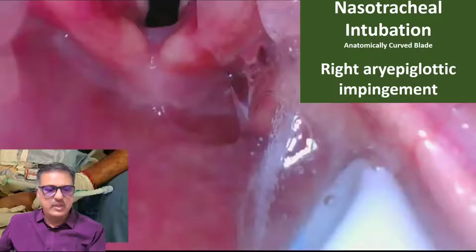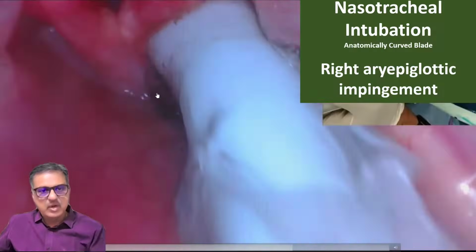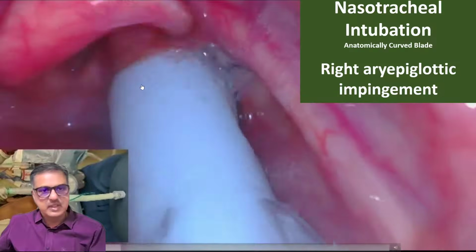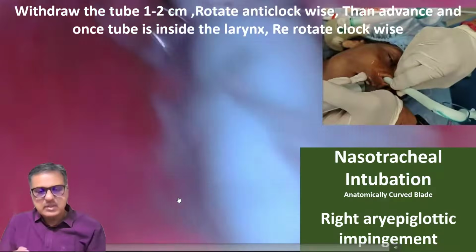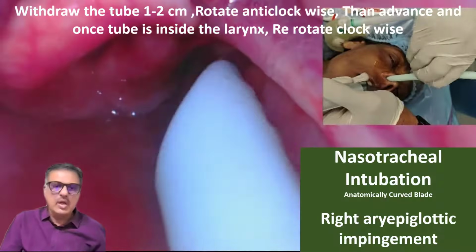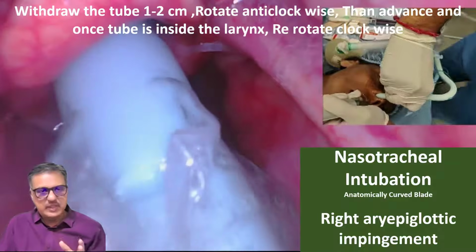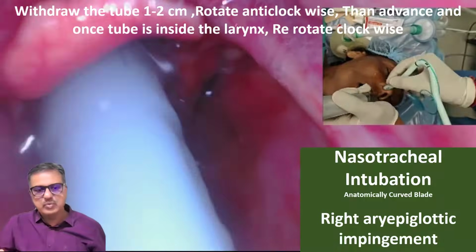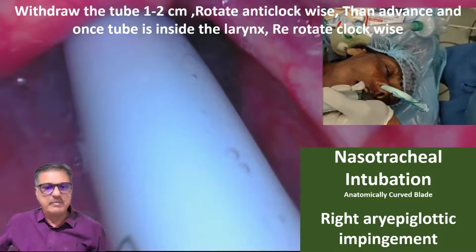Look at this video. In this video, the endotracheal tube, the nasotracheal tube, is impinging over the right aryepiglottic fold. I'm showing it again. It's impinging on the right aryepiglottic fold. So in such a case, before advancing the tube, withdraw the tube a little bit and do an anti-clockwise rotation. Make the tube trajectory towards the larynx. Advance the tube, and once you are inside the larynx, rotate the tube towards the right side. This will overcome this right aryepiglottic impingement.